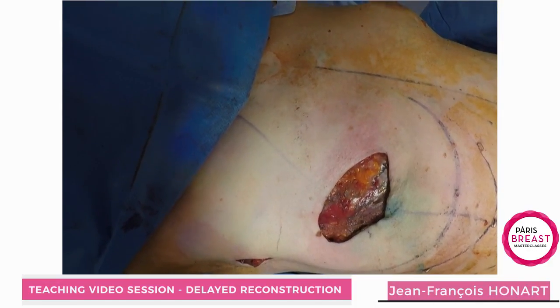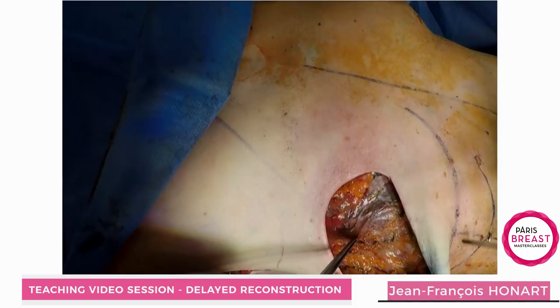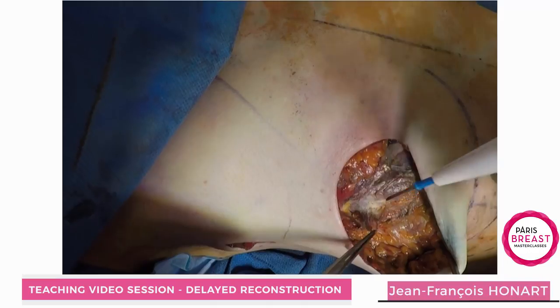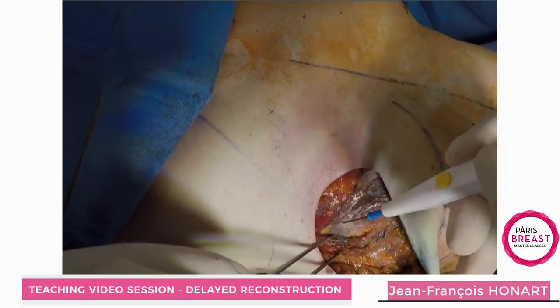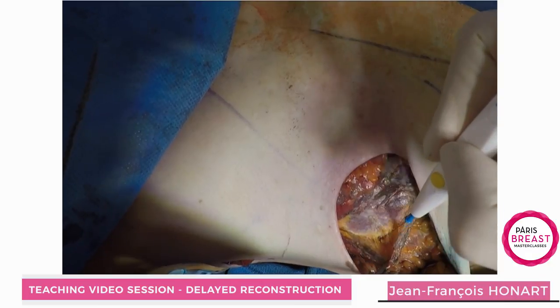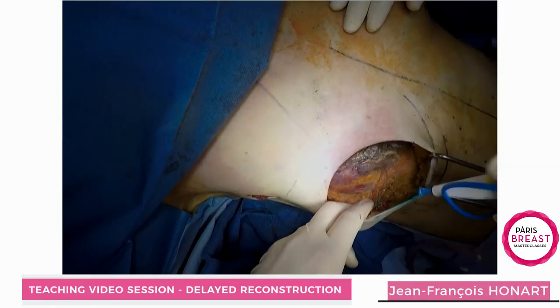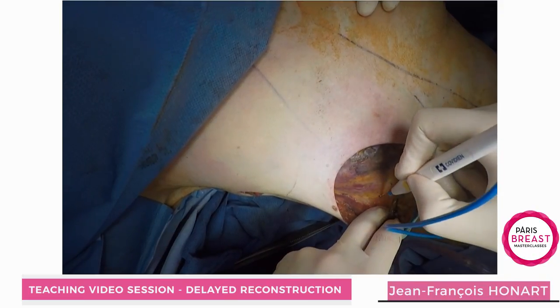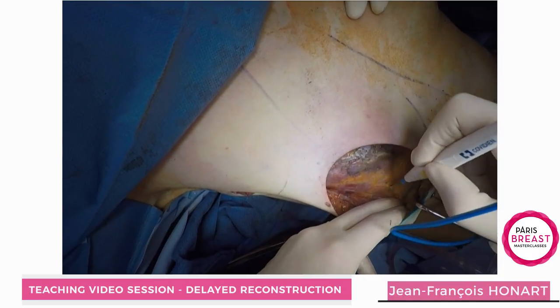This is the tissue that you are going to raise. This fascia is very thin, which is why today we prefer to use meshes or ADM. You have to go as deep as you can to have sufficient flexibility to close the implant pocket. With the abdominal advancement flap you will also increase the implant pocket.